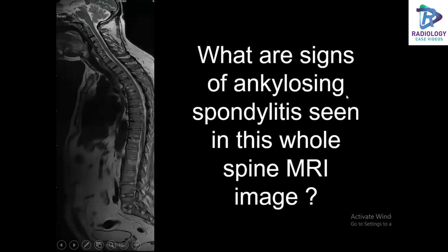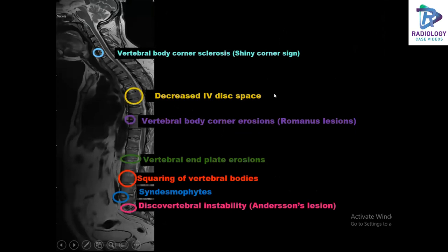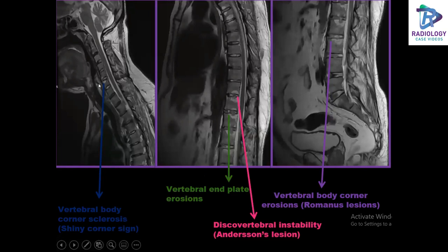This whole spine MRI image shows findings of the shiny corner sign (vertebral body corner sclerosis), decreased intervertebral disc space, vertebral body corner erosions (Romanus lesions), vertebral end plate erosions, squaring of the vertebral bodies, syndesmophytes, and discovertebral instability (Anderson's lesions). A magnified view confirms the same findings: shiny corner sign, vertebral end plate erosions, discovertebral instability, and Romanus lesions.